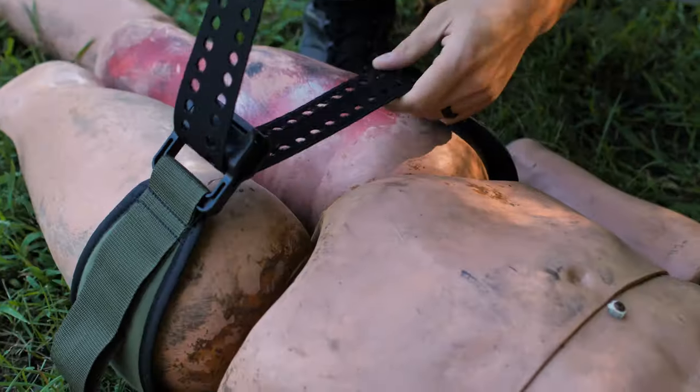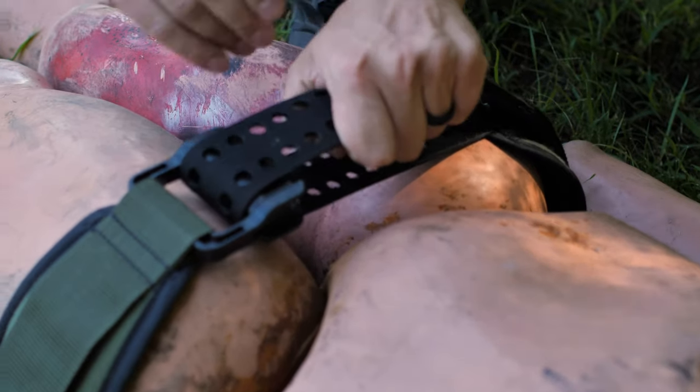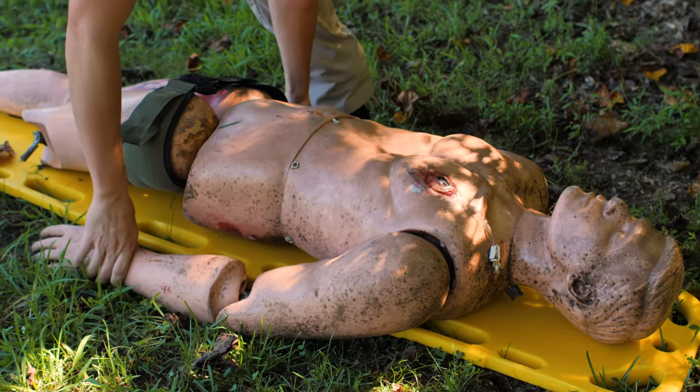An important part of a trauma assessment and treatment, and also part of the C in the MARCH algorithm, is to apply a pelvic binder when indicated. We're going to run through how to apply a pelvic binder, when you should apply one, and what to do if you don't have a commercial pelvic binder available.